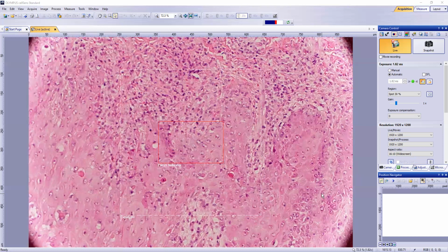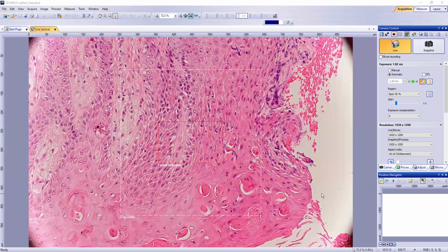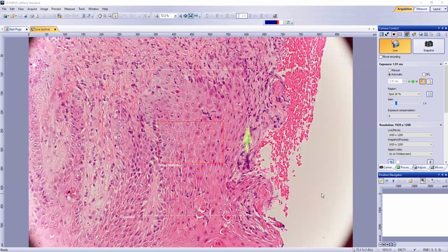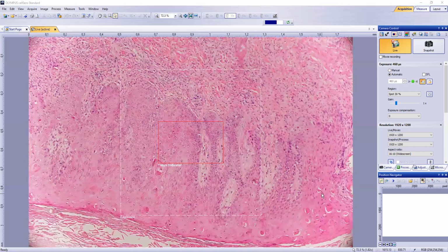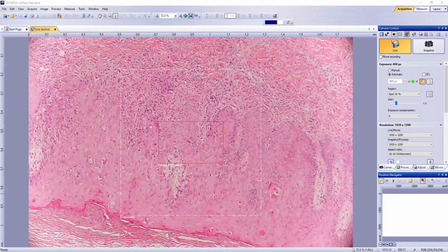Another feature that you'll see are neutrophils. So you might see neutrophils if you have confluent zones of epidermal necrosis, like here. You might start to see neutrophils tracking up into the epidermis in those areas, okay? There's a little bit of crush happening here, but there might be some neutrophils lining up there and starting to track up into the epidermis, okay? And then sometimes vesiculation can be seen in the papillary dermis, but mostly what you'll see is just edema of the papillary dermis. So the papillary dermal collagen has that pale pink color, which is indicative of some edema in the papillary dermis, okay?